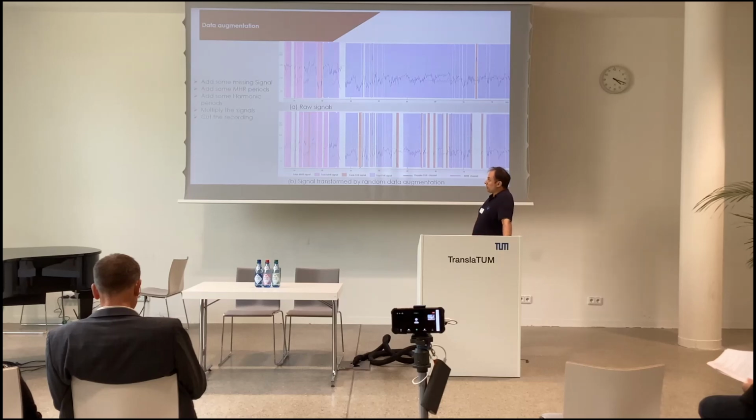We realized data augmentation. This was pretty easy for this problem because we can take good signals with almost no noise, and we can add some missing signal periods, and some false signal periods by taking the maternal heart rate value or taking the harmonic of the fetal heart rate.